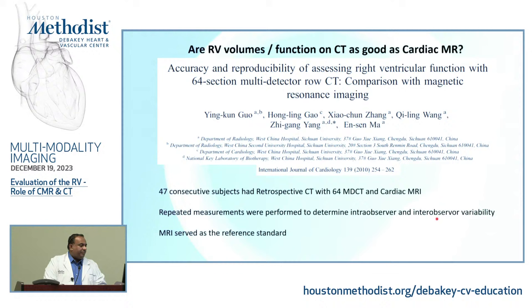This is a nice study from 2010 in the International Journal of Cardiology, done actually in China, that compared 47 consecutive subjects who had a retrospective CT done with a 64 slice scanner and also had a cardiac MRI within 2 weeks of each other. To look at the reliability of the CT measurements, they looked at the intra-observer and inter-observer variability, and then of course MRI served as the reference standard.